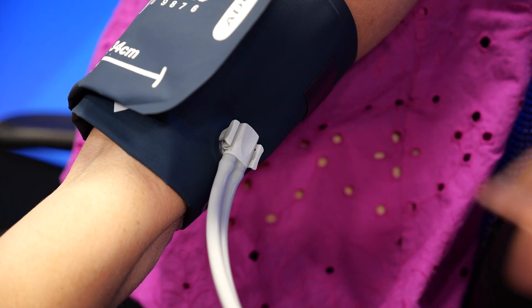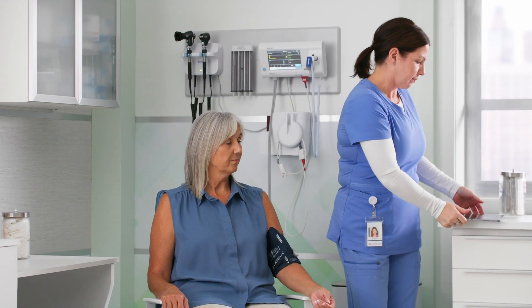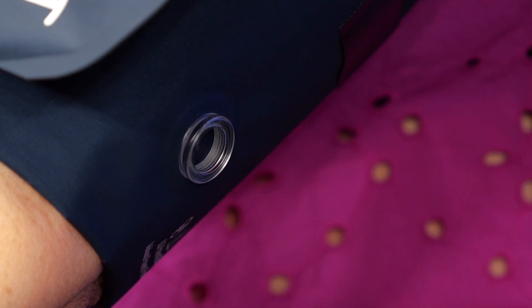Fifth, detach. The last step is to remove the FlexiPort fitting once the blood pressure measurement is complete. This is done simply by squeezing the FlexiPort fitting and pulling away to detach from the cuff.